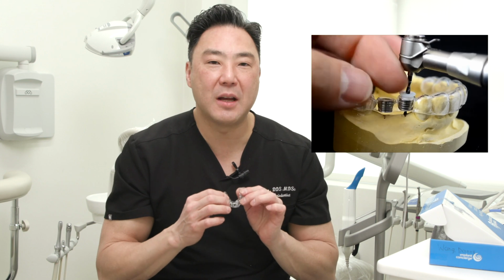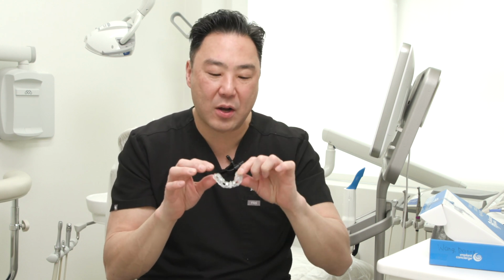case ahead of time. Remember, in a previous episode, we said we want to know the final goal, what the final destination is in terms of our crowns and teeth. And even with implants, we need to know precisely where the implants should be positioned and placed. A surgical guide allows us to place those implants very precisely because we planned it ahead of time. Now, how do I know where they need to be?